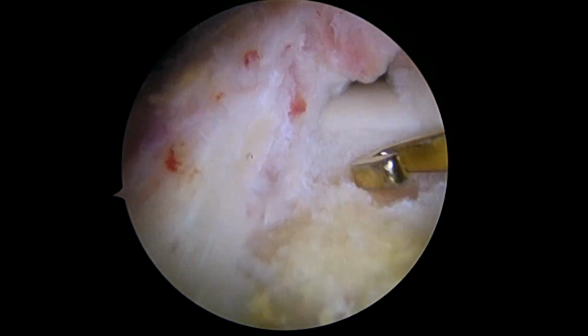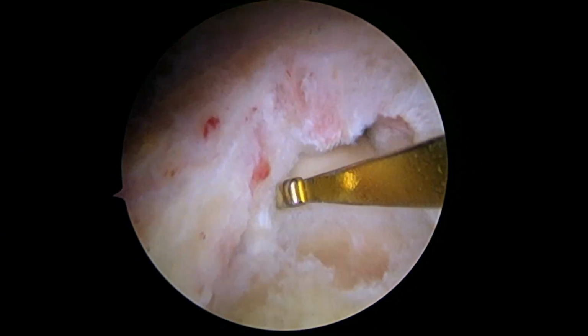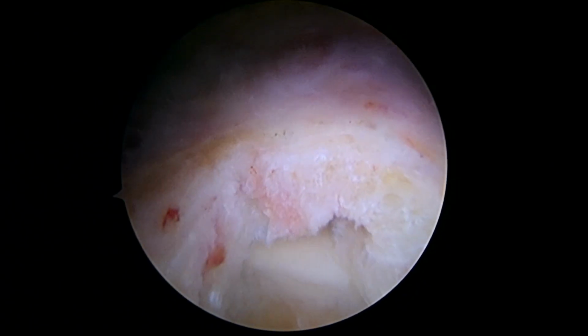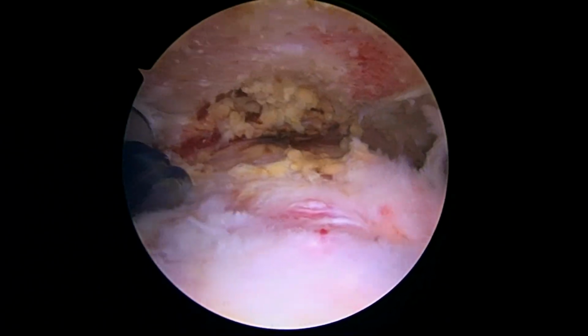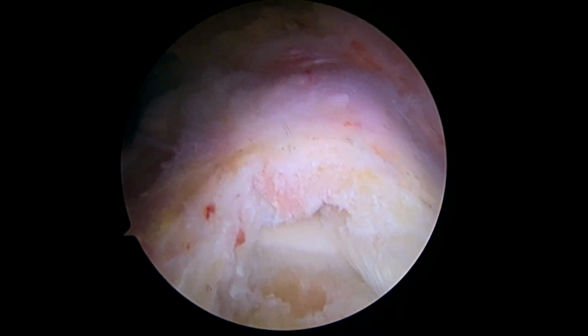We're going to place our suture anchor down right where that crochet hook is touching the bone, right there. And just tack this down for you. Just wanted to show you where we're starting. Just to give you the overall picture, this is the subacromial space. And there's the tear right there.